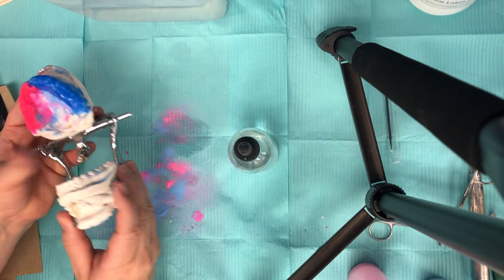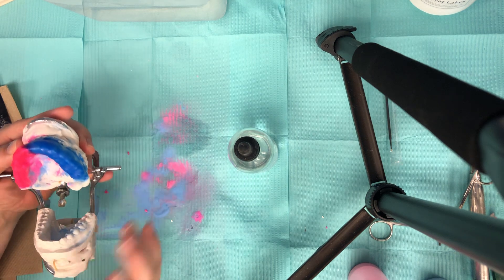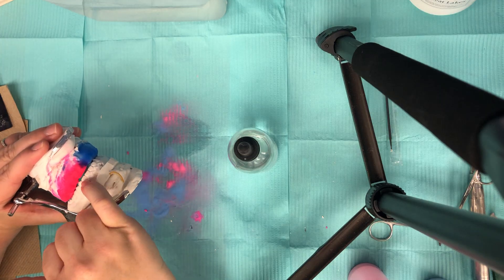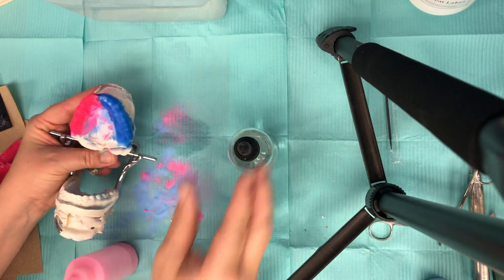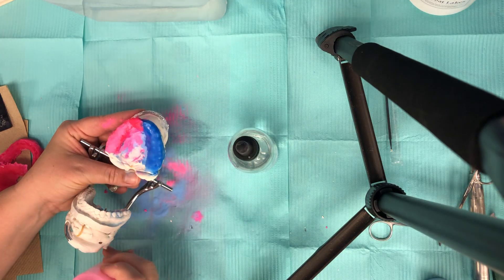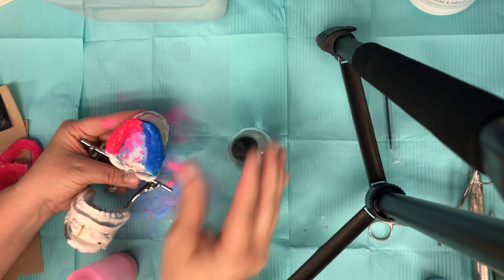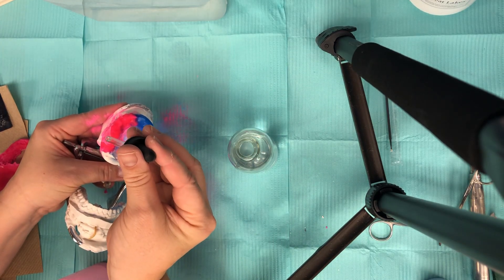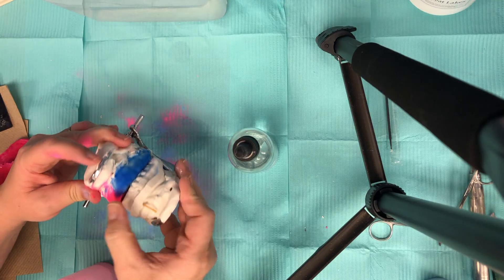Now comes the fun part. We're going to close this and you can see how it's touching in three areas. In order to make all of the teeth touch at the same time we're gonna need to build it up in those areas that have space between them. So let's start with the posterior on the upper right — add a little bit of monomer so it sticks better — and just build it up. You can see it touches in that posterior, so we're just going to work our way around.